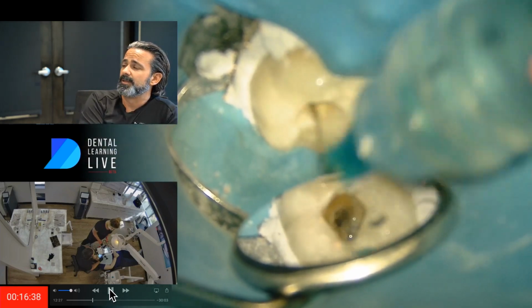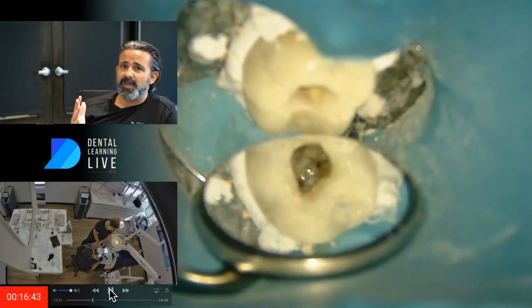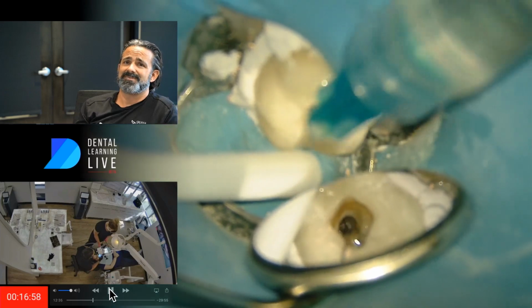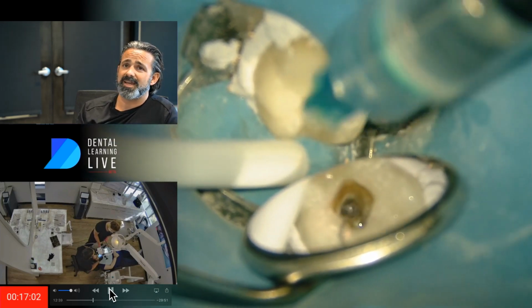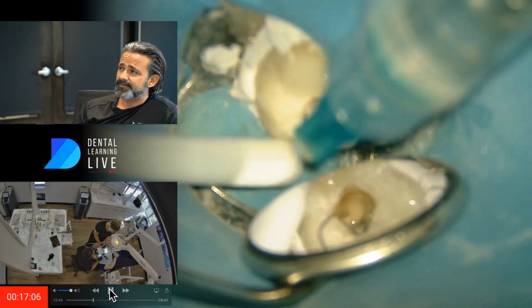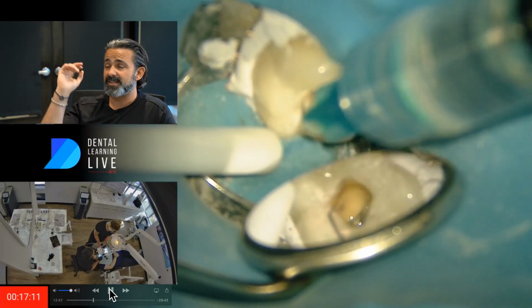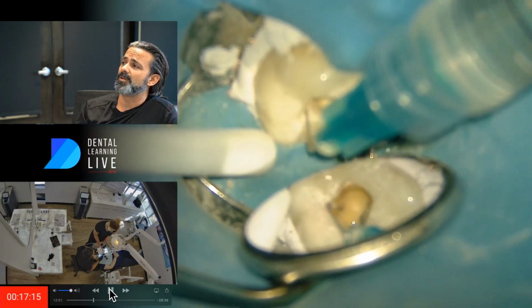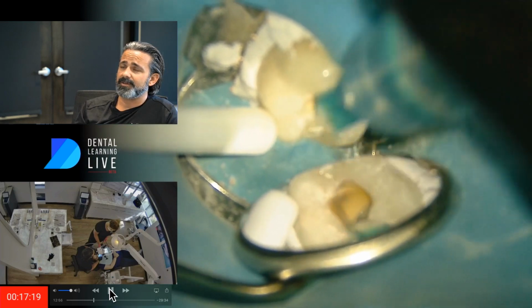And you know, if you didn't do this technique and you just went all mechanical through it, you're obviously enlarging things, but you're also making that denser, more packed tighter up into that little aberrant space that I'm working in. Now if you look, you'll start seeing that pink cloud because I'm just getting that to soften and strip off, dissolve off that wall. So let's see how I do.